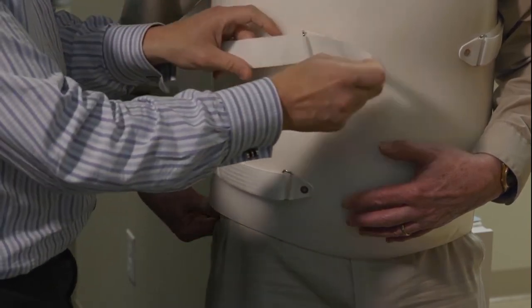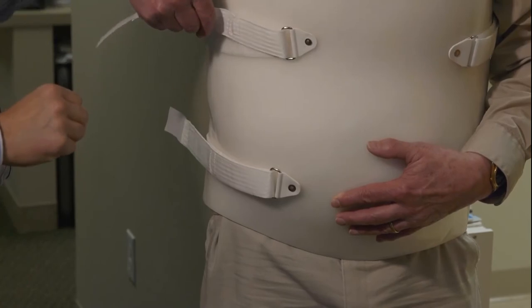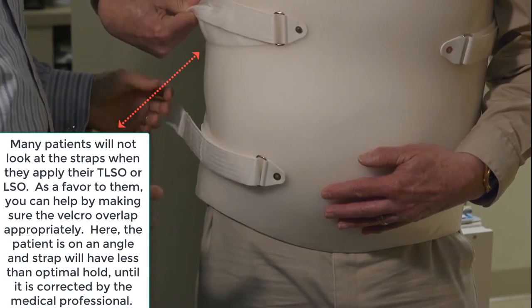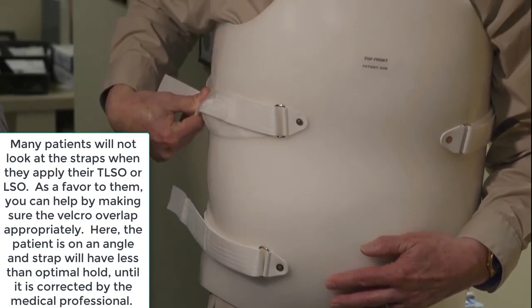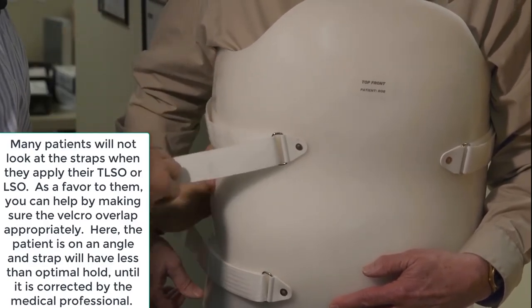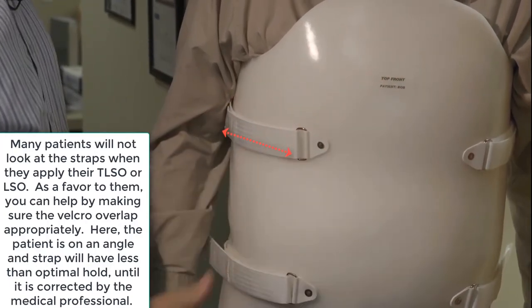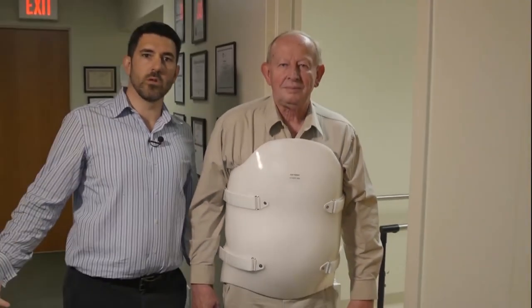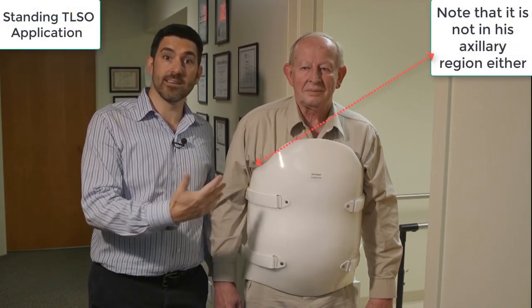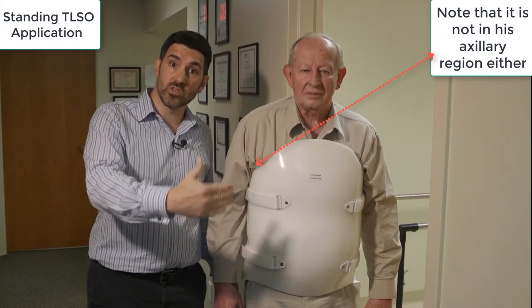We're going to do the same thing on this side. Bob, I'm going to have you do this one. He just pulled back on the strap, and you can see he would have never been able to do that against the wall because it would have bottomed out. I'm going to cinch it up a little bit more. Right now Bob's in a more straight position and it's not in his neck. We're going to do this same exact process in a minute with him sitting, and you can see where the problem happens.